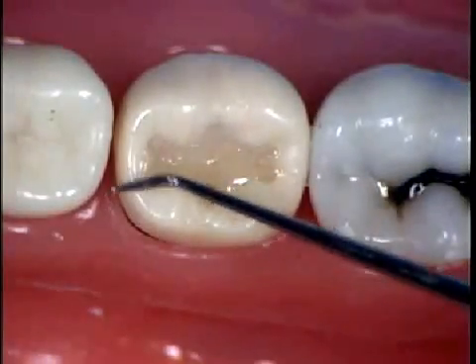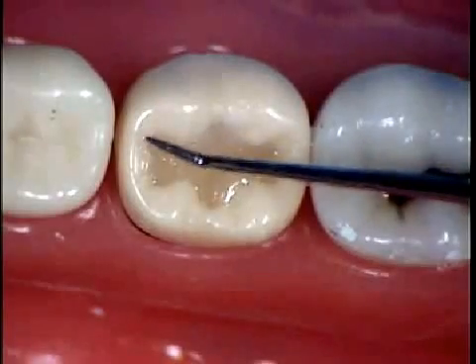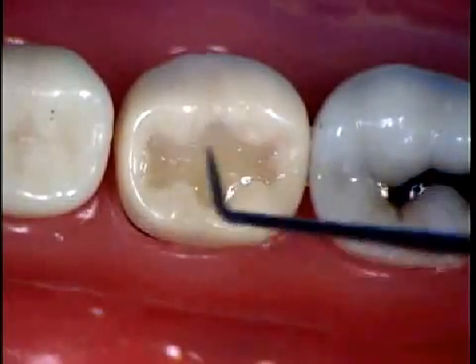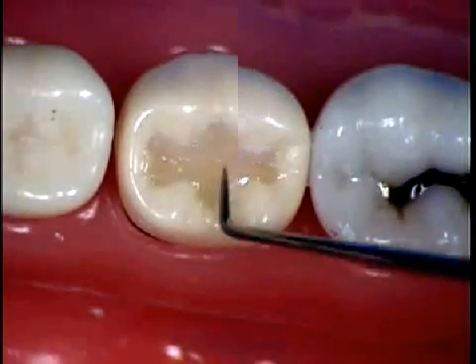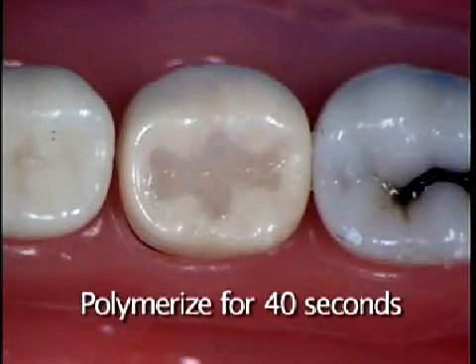On the last layer, you want to shape with your instrument and take your time on the placement of your anatomy before you polymerize with the light. This is going to minimize the time of finishing. After the placement of the anatomy, you want to polymerize for 40 seconds.